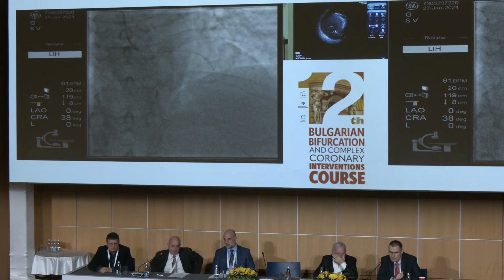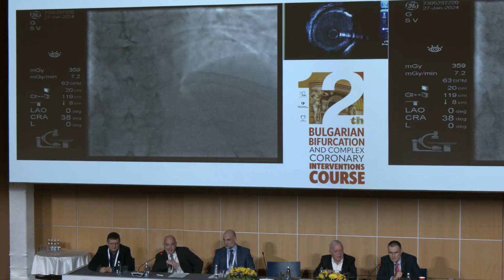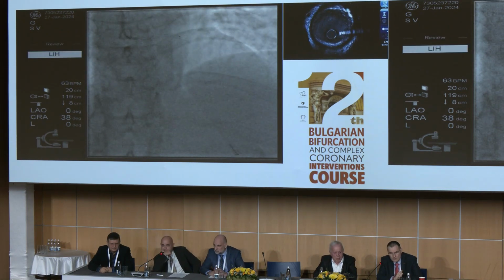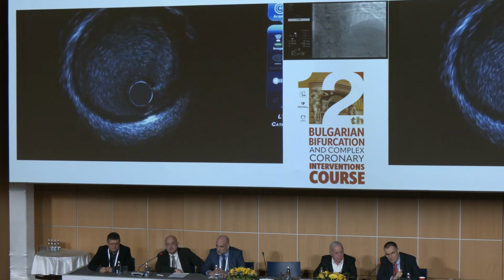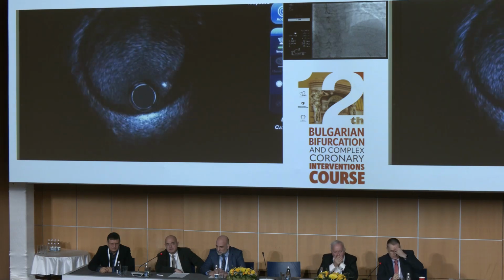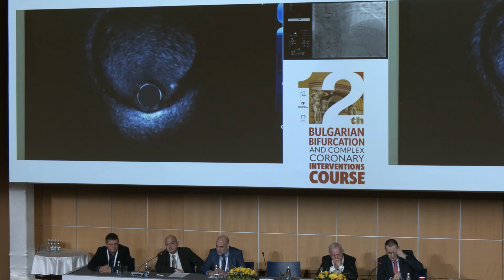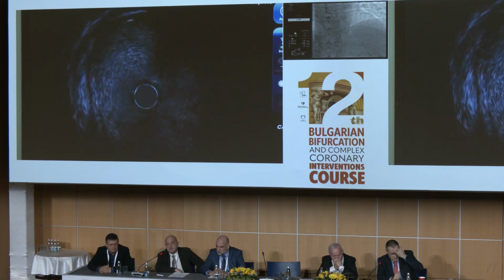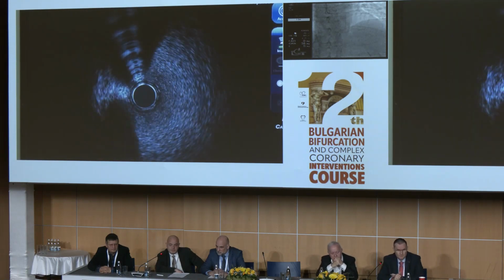And this is a good proximal IVUS part, almost OCT-like IVUS. Yes, this is high definition. Very good device. Do you make automatic or manual pullback? No, automatic. High definition is only possible by automatic pullback. Rotational systems. So this should be the ostium of the aorta, which has apparently no disease.